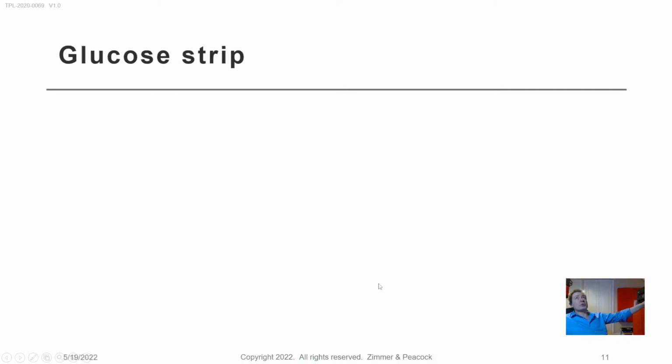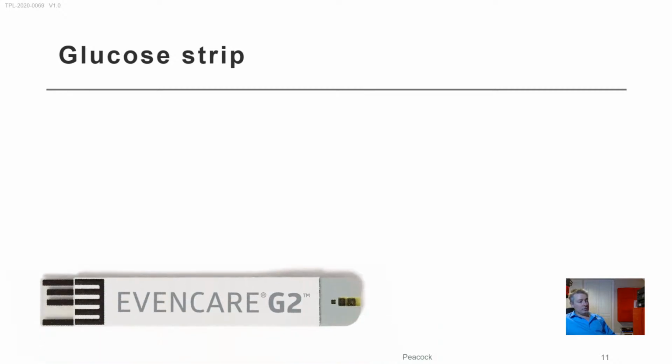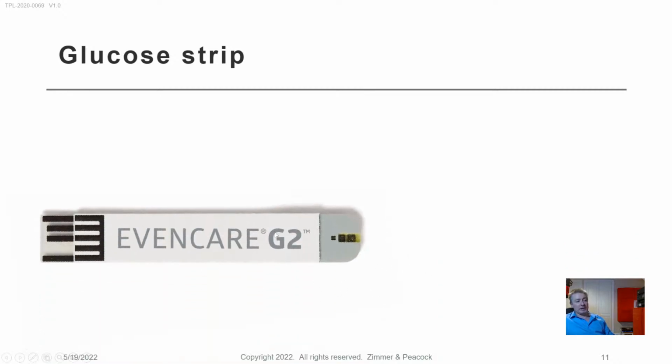Now they might want to actually repurpose a glucose strip. So what I've shown here, this is a glucose strip. I feel like the inquirer already knows this, but when you look at a glucose strip and you see this yellow color, I used to think that this yellow color was glucose oxidase, because glucose oxidase in solution is yellow. I realize these days it might actually be the ferricyanide that is producing that yellow color because it's in higher concentration, but maybe a bit of both. But many commercial glucose strips do have ferricyanide, and they have glucose oxidase on them and ferricyanide on them.